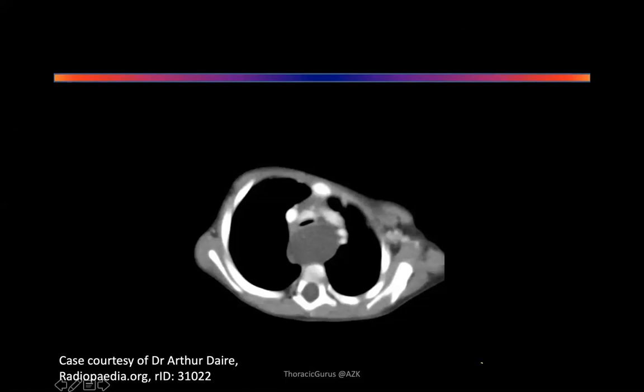So it's a chest CT scan, mediastinal window. We don't have identification. We can see homogeneous opacity at the posterior mediastinum behind the trachea, with some compression on the trachea causing narrowing, like the trachea shape has been changed to an oval shape. Excellent. Hemithoraces, they don't seem equal on this view. We see the right hemithorax as if it has more volume than the left hemithorax. We need to see other views to identify.